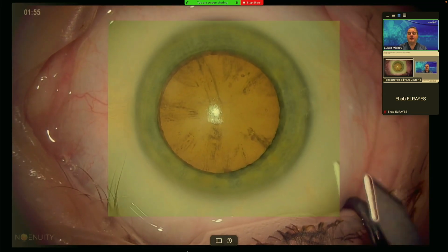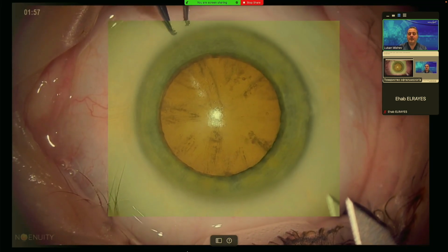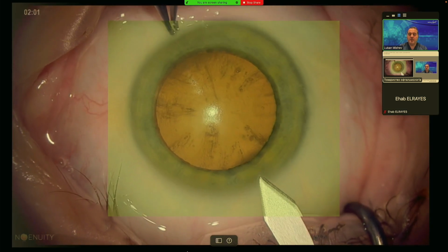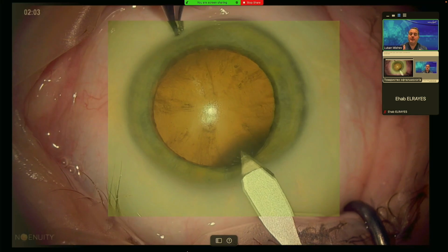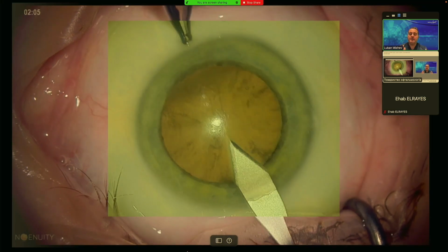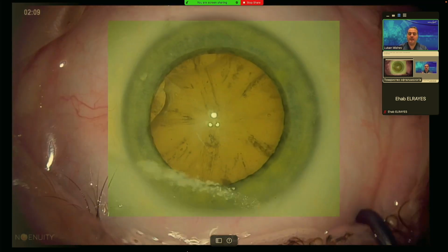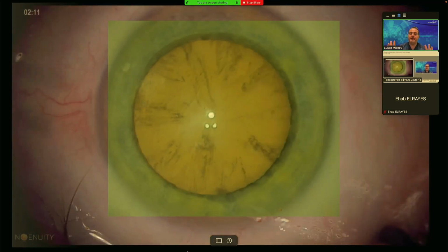As you see here in the limbus and in the conjunctiva, the vessels are not like in the normal image. So the future will be applying areas of interest and filtering only that area, and the rest of the eye should look normal.